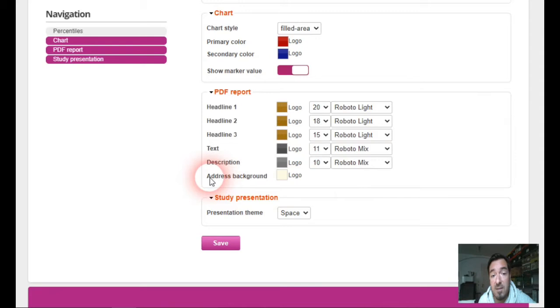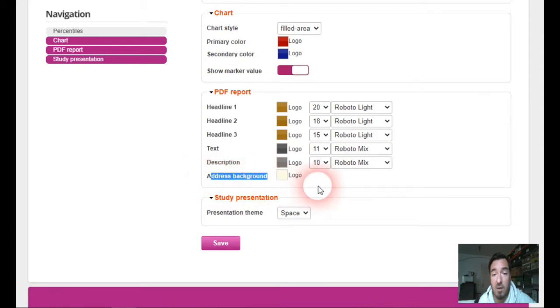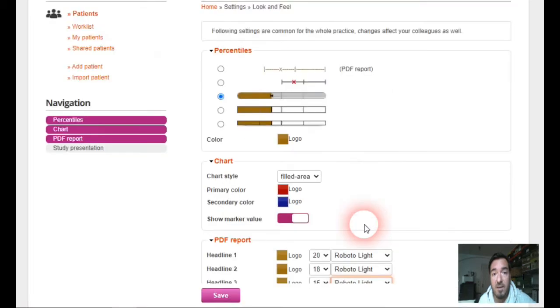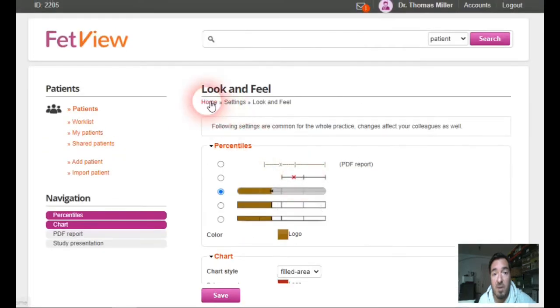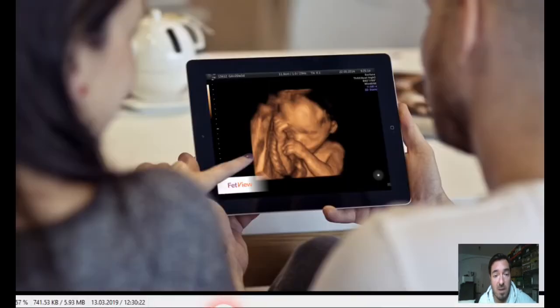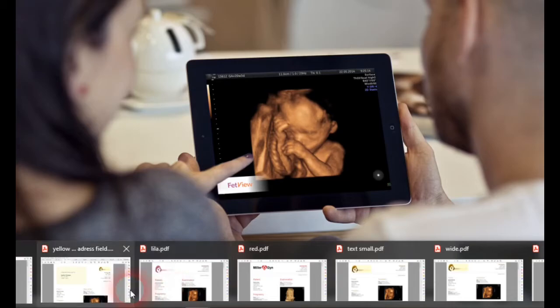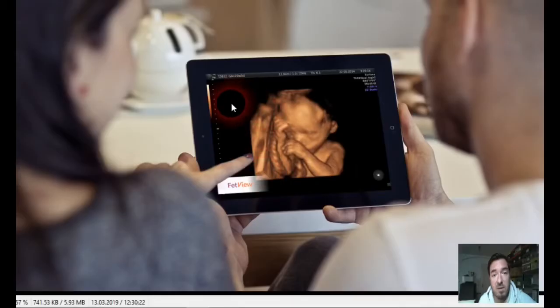You can even set up the color of the address background here. I will show you how it looks like in practice.